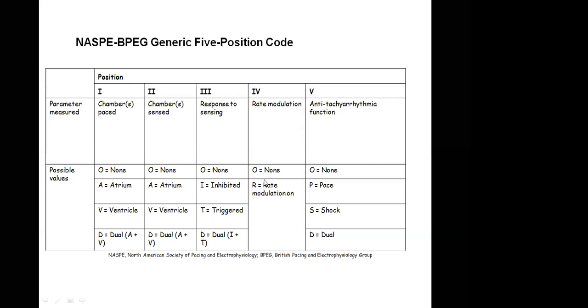But when the patient starts running for a bus, or running for a day's activity, or climbing the stairs, his heart rate will constantly be at 60 and he's going to have syncope. Are you getting it? Because his heart rate is not increasing. So that is where you must activate the rate modulation so that it can meet up with the patient's heart rate activity. I hope it's clear, sir.